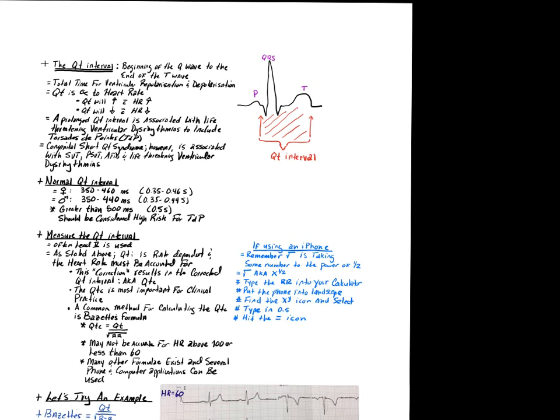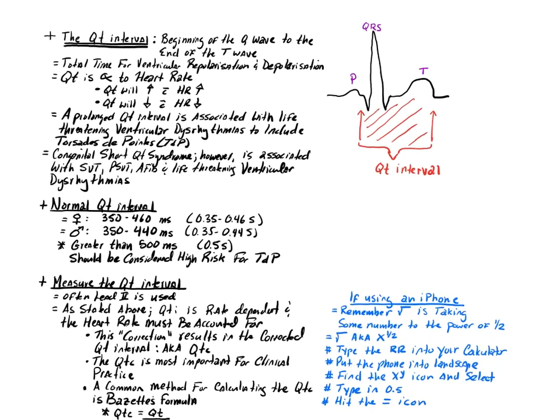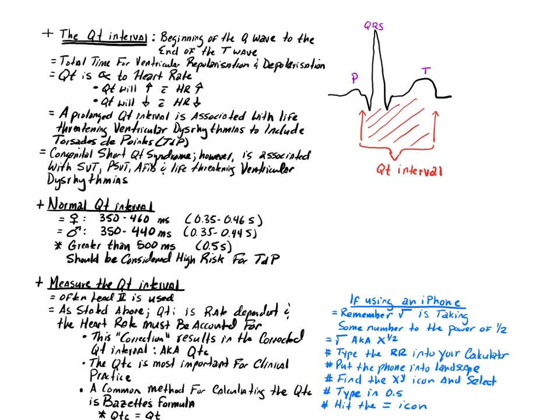All right, but I want to focus more on getting the toolbox ready to go here. Moving right along, we're going to talk about the QT interval, the last major thing that we need to discuss in class. Let's zoom in here. So what is the QT interval? So the QT interval begins on the Q wave, and where do you suppose it ends? Beginning or end of the T wave? End of the T wave, right? So the beginning of the Q wave to the end of the T wave.